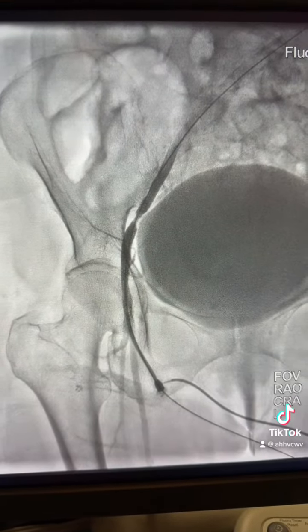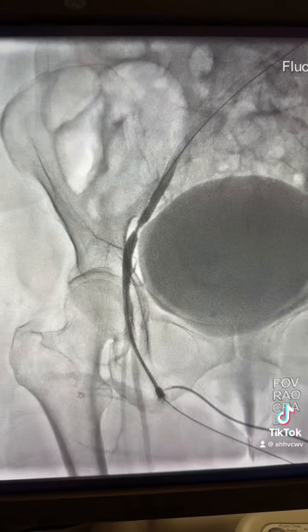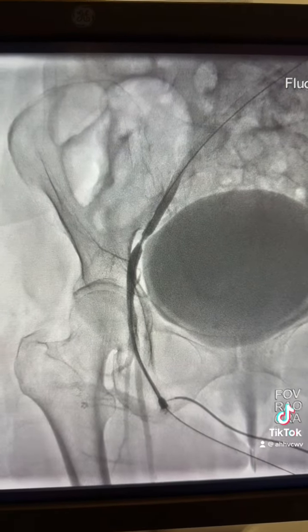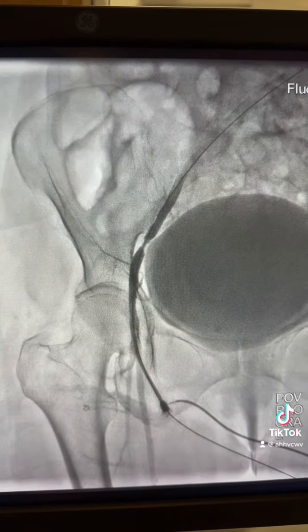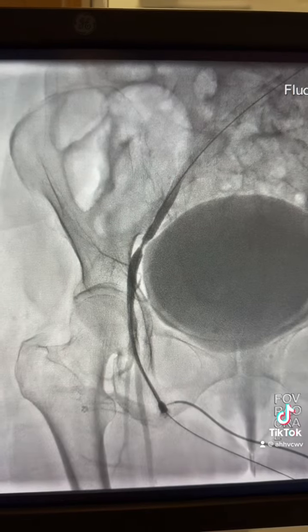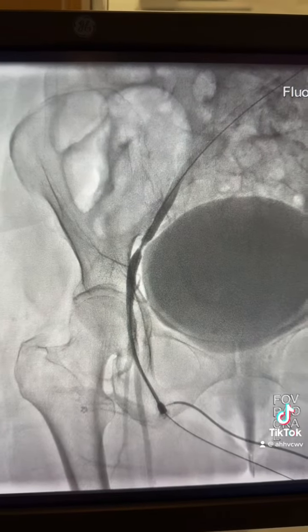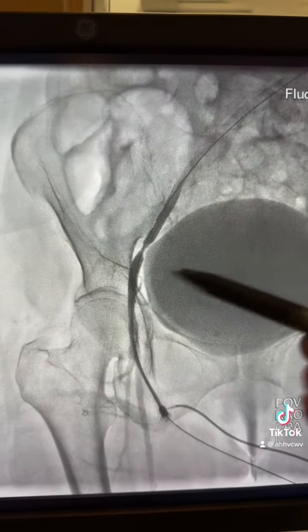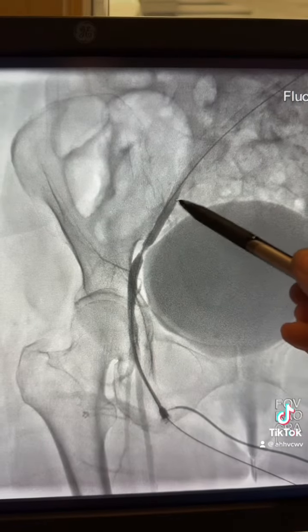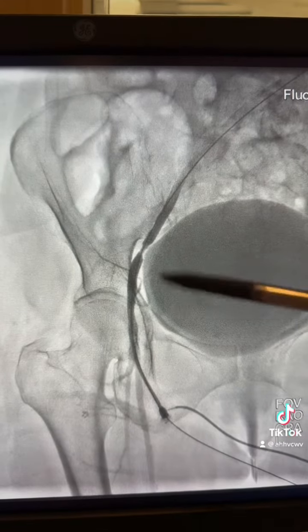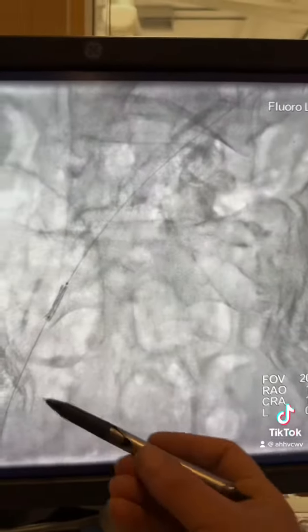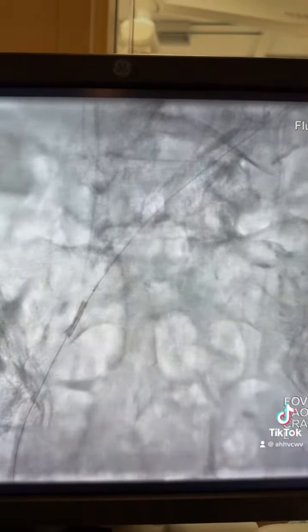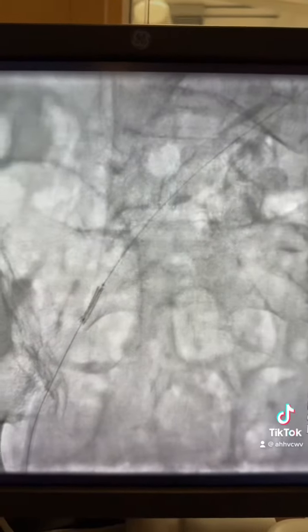The plan was to wire through the sheath with a run-through wire and then advance the 6.0×15mm stent directly. However, unfortunately the stent was dislodged — you can see here the lesion location, and the stent was dislodged more distally.